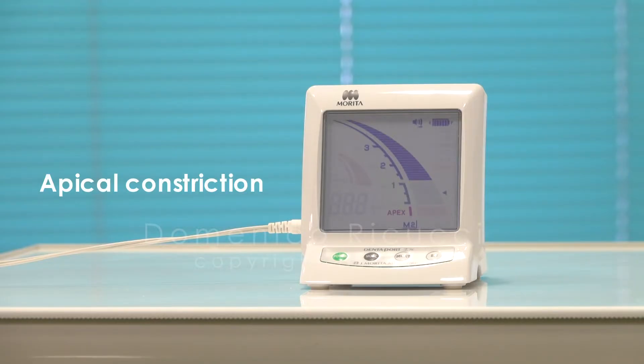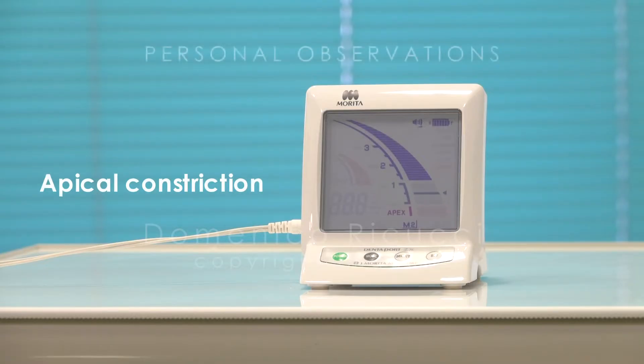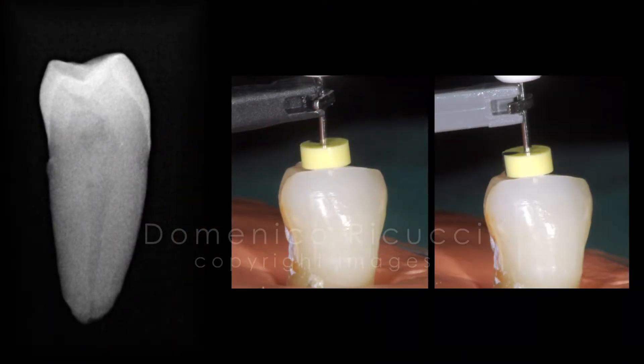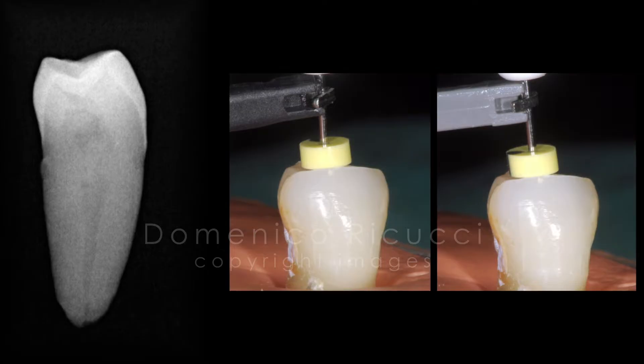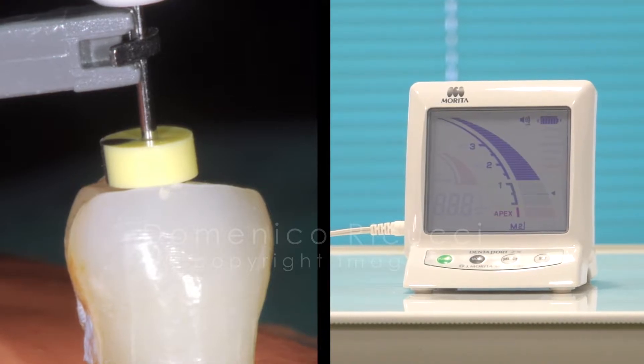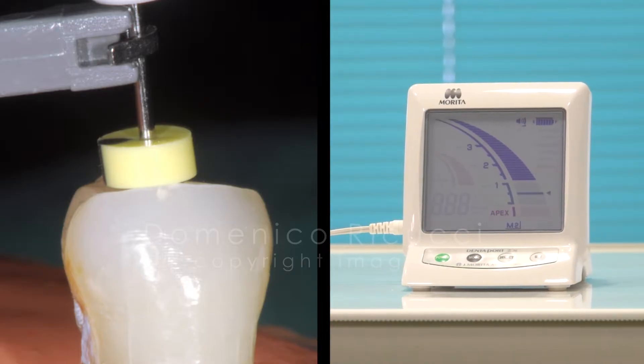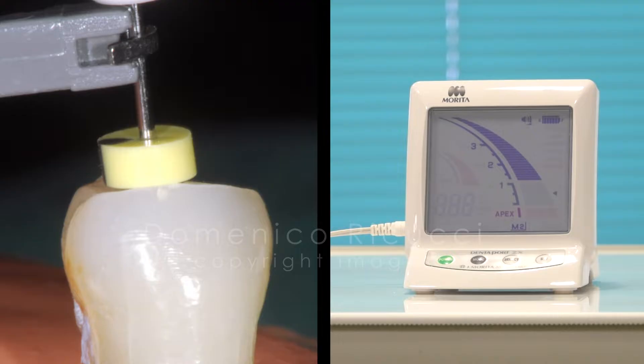With the Dentaport Morita, the apical constriction is reached at the end of the blue scale. Pay attention — this derives from my personal observations. I used a certain number of teeth embedded in an alginate model developed specifically for testing apex locators. I will use here one case, a mandibular premolar that exemplifies the observations. Using the Morita device, a number 15K file was blocked when the end of the blue scale was reached, indicating the apical constriction.